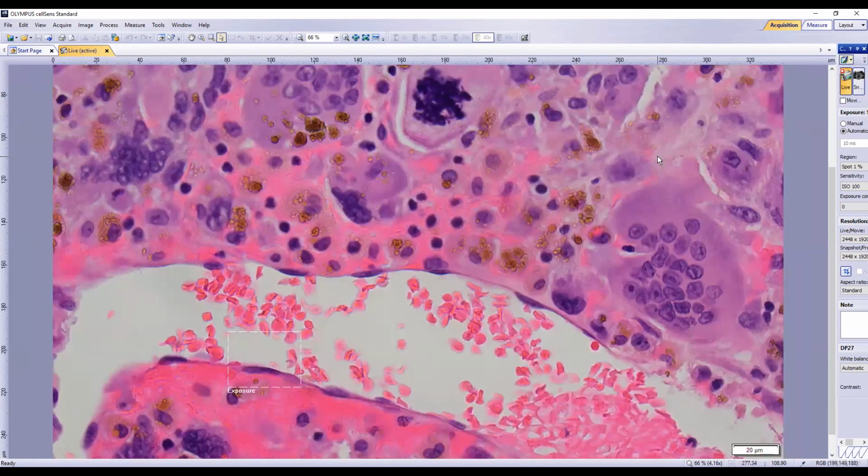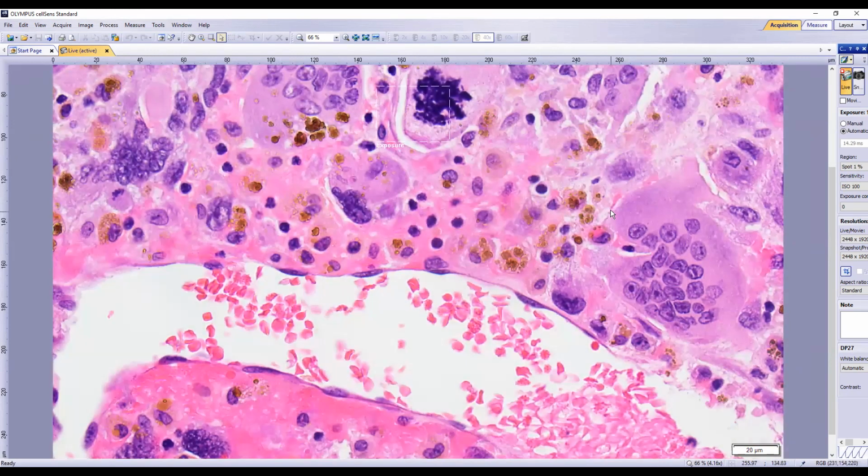It's almost like an anaplastic carcinoma of pancreas, but it is so rare that I don't want to utter it. You're close, but not there. You're very close. So this is actually undifferentiated carcinoma of the pancreas with osteoclast-like giant cells.